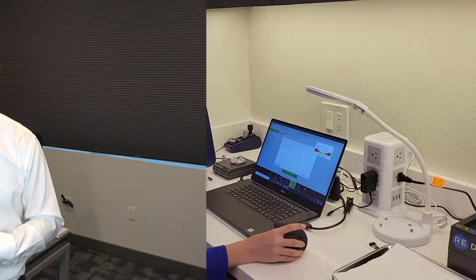Hey guys, Bryce Altas here, Doctor of Audiology at Applied Hearing Solutions in Phoenix, Arizona. Today I'm going to be showing you how to set up the Oticon Connect Clip with your Oticon hearing aids, as well as how to use the Connect Clip as a remote control and remote microphone.